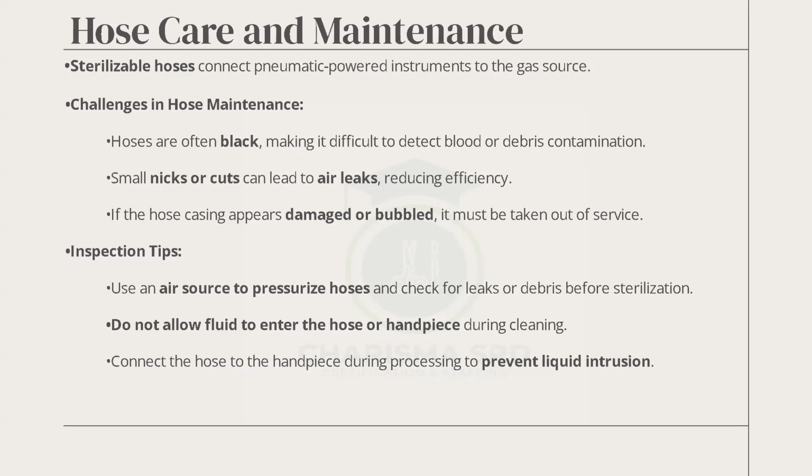Inspection: use an air source to pressurize hoses and check for leaks or debris before sterilization. In some hospitals, they have air tanks that we can use to check whether the hose is functioning. But not all hospitals have that.